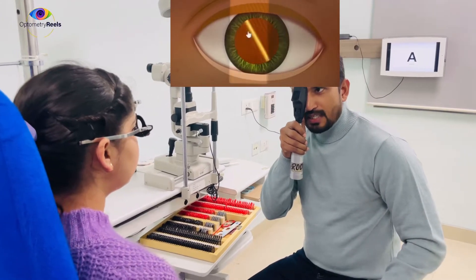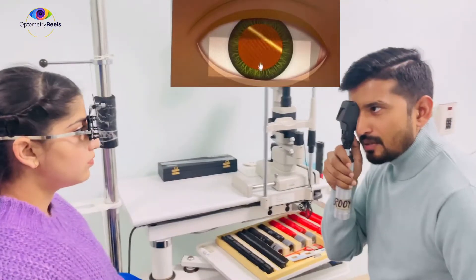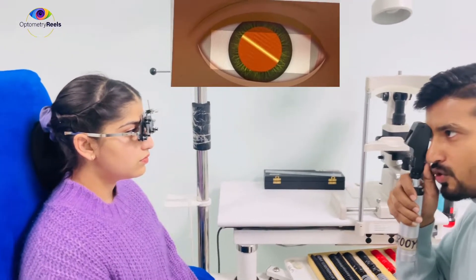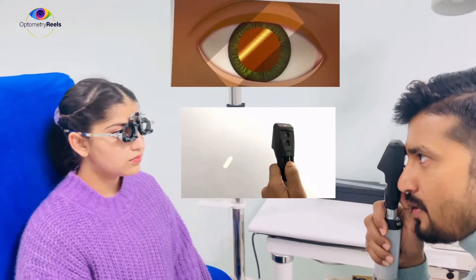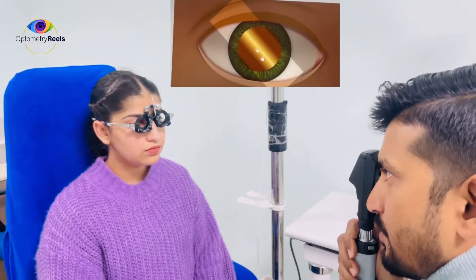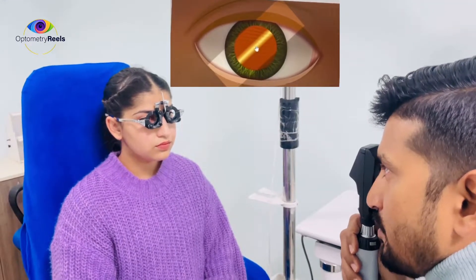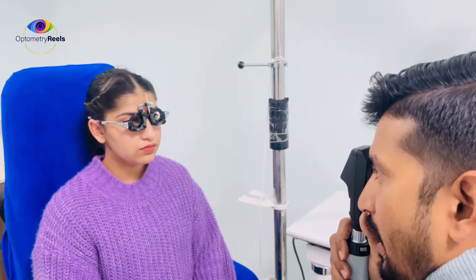So friends, what I can see is the glow in two different meridians, but the glow is not coincided with the streak of my retinoscope, so I am going to make it parallel to it. At 135 I can see against movement, and at 45 I can see with movement. So for 45 I am going to use the plus spherical lenses, and for 135 I will be using minus cylindrical lenses to neutralize them.